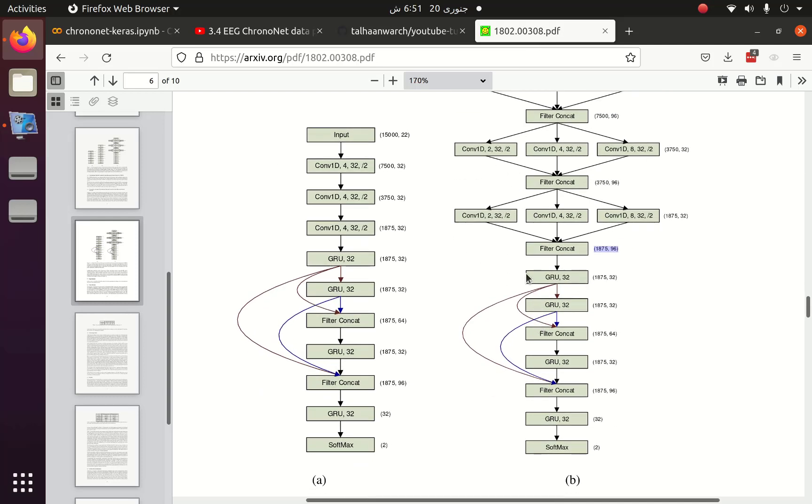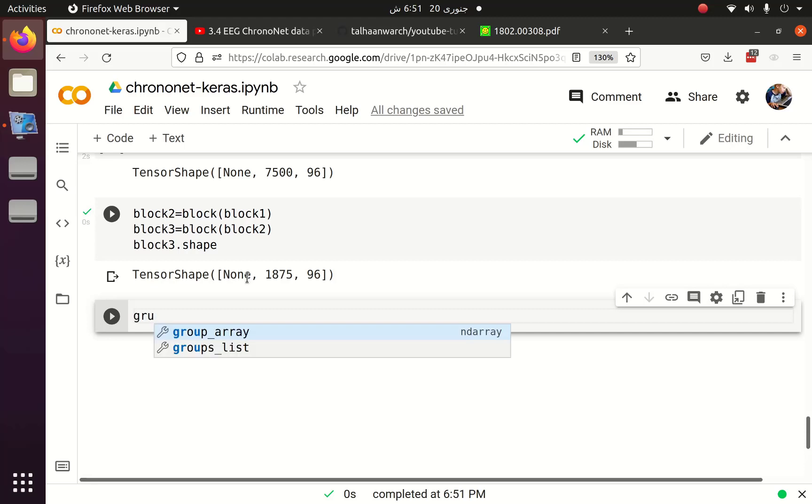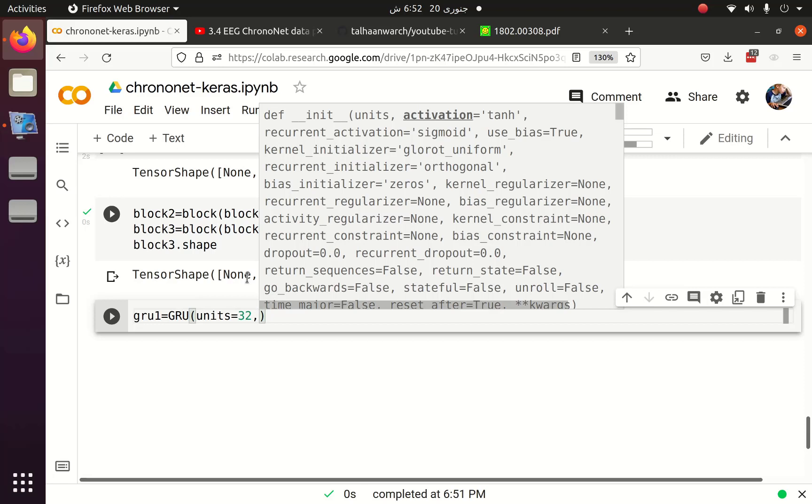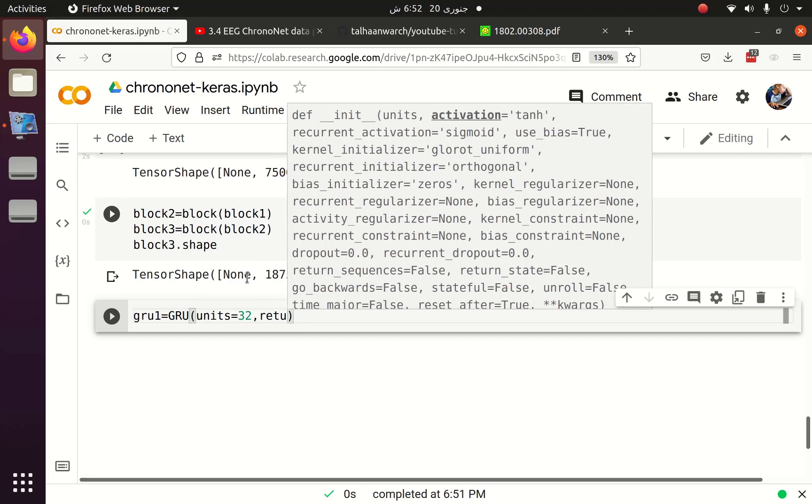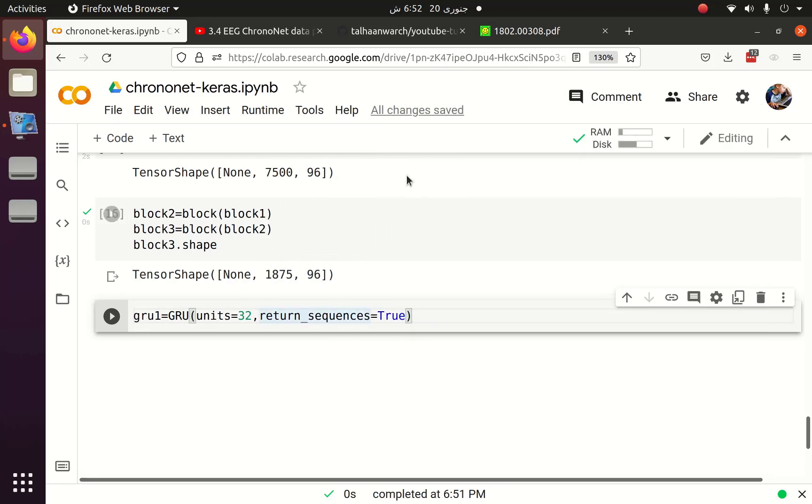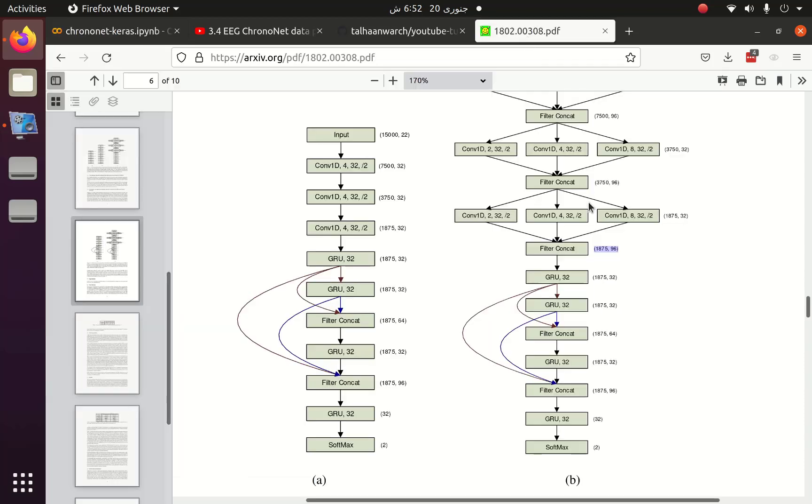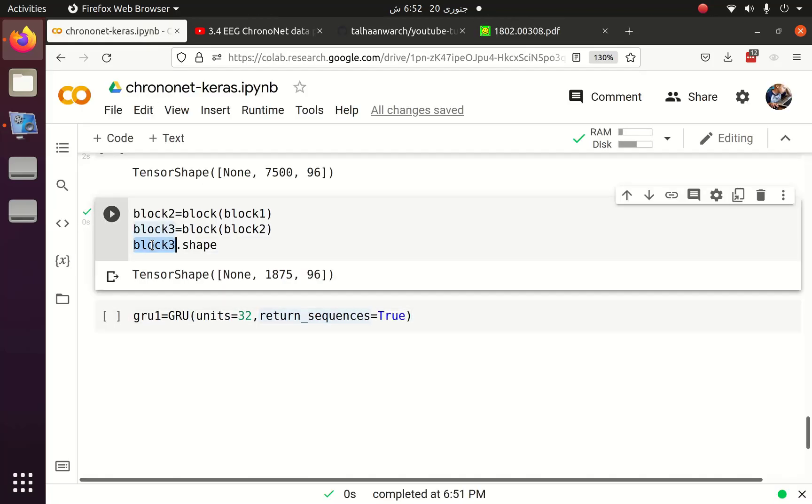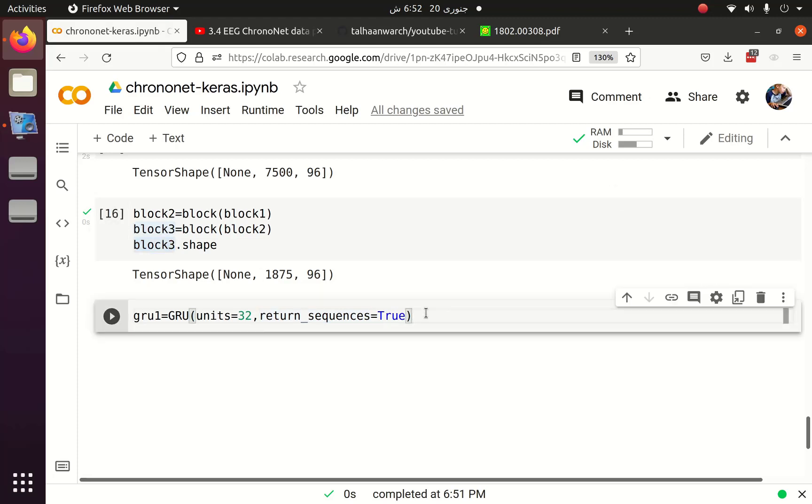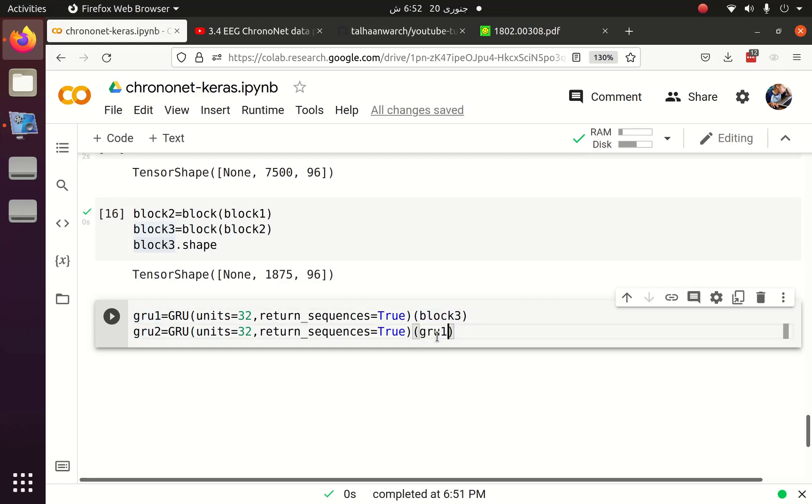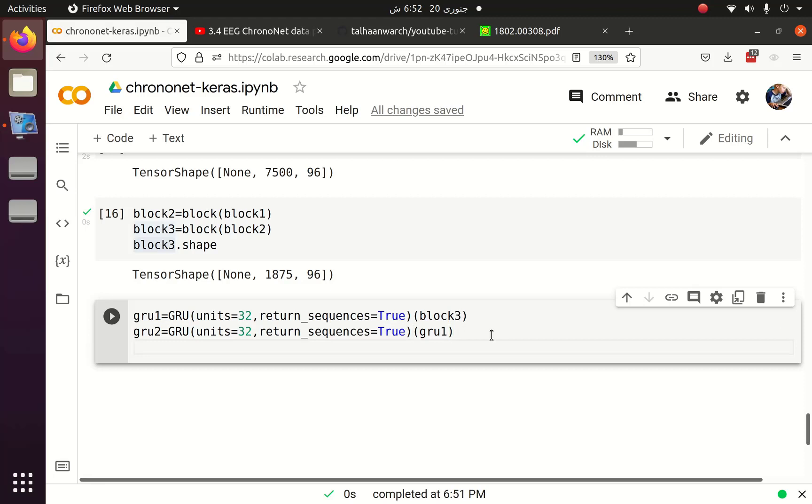After that we have to implement the GRU layers. We have four GRU layers. The first GRU layer have units 32. We have to pass the output of block three as the input of first GRU layer. The second GRU layer also have 32 units and the output of GRU1 will be the input of GRU2. After that we will concatenate the output of GRU1 and GRU2.